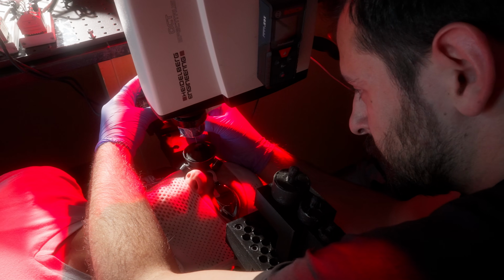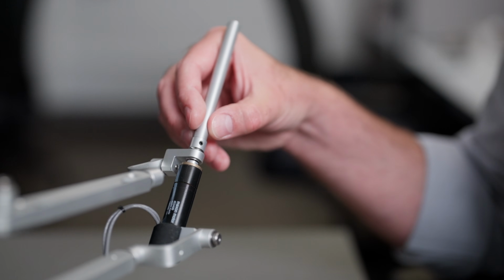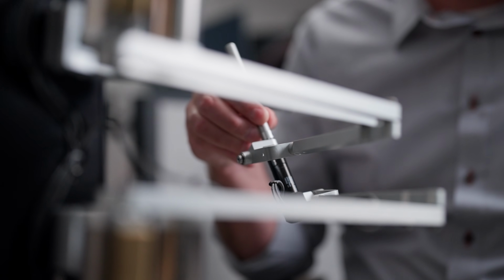The goal has always been to basically make a surgeon have superhuman hands. And using a robotic device where I'm using a joystick, but it's using the same instruments that I would normally use in my hand, it is compensating both for what I do and what the patient is doing. That is a very exciting new frontier in robotic surgery. We haven't taken any control away from the surgeons at all. They're still completely in control of the tool. It just will be easier for them to do the job they're trying to do.